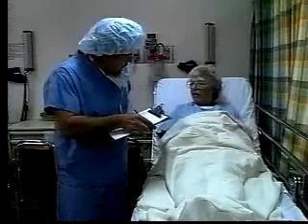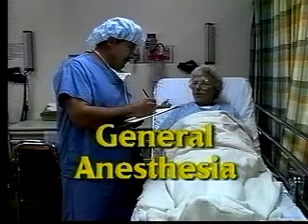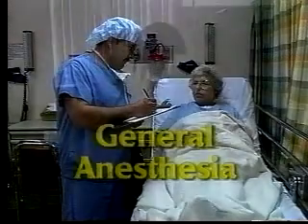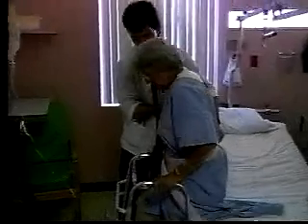General anesthesia is routinely used for this type of surgery. This puts you completely asleep. The entire surgical process takes about an hour and a half. That same day, a physical therapist will start working with you. Your activities will include walking with a walker and leg brace, and strengthening exercises. The usual stay in the hospital is 1 to 2 days.